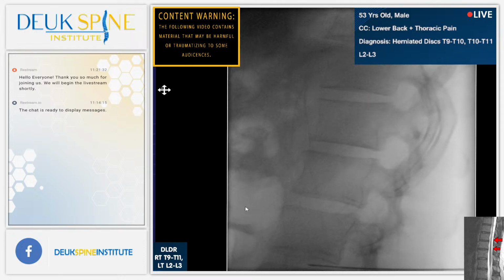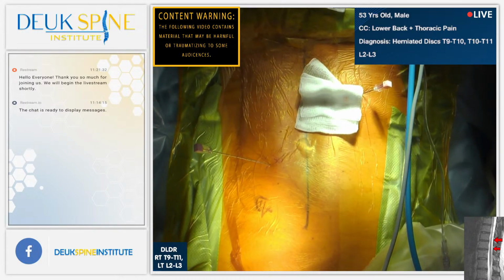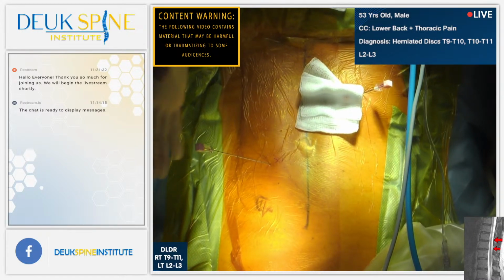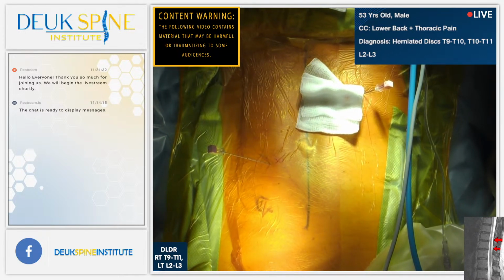So now we know that's L2, L1, T12, T11, T10. And we're doing 10-11, right? Yes, sir. Everyone agrees? All right, we're doing it from my side, the right side, because I'm standing on the right side. So keep that view right there, and we're going to go for the 10-11, and then we'll do the disc above that once we've accessed it. So this is one of the strategies we use in order to make sure we're going to the right place in the spine. It's counting. We call that localization.